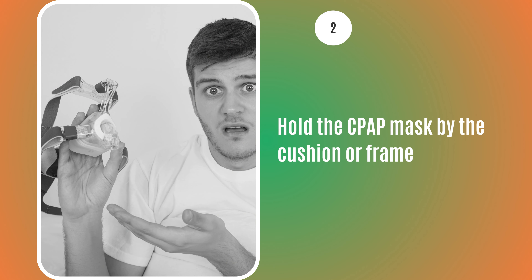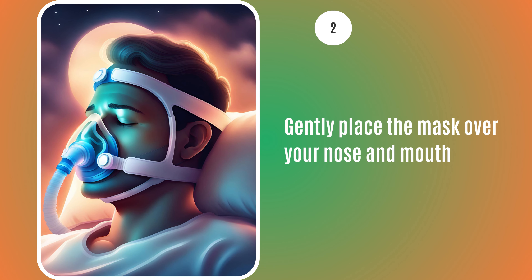Then, hold the CPAP mask by the cushion or frame, not the tubing. Gently place the mask over your nose and mouth, positioning it so that it fits snugly but not too tight.